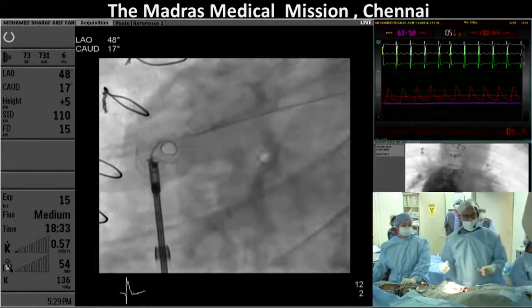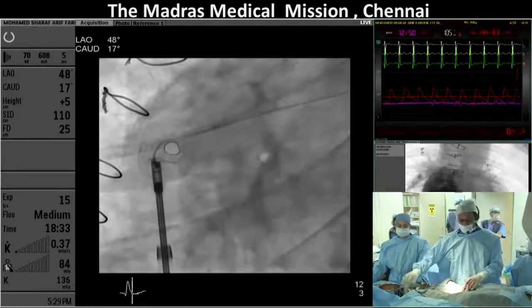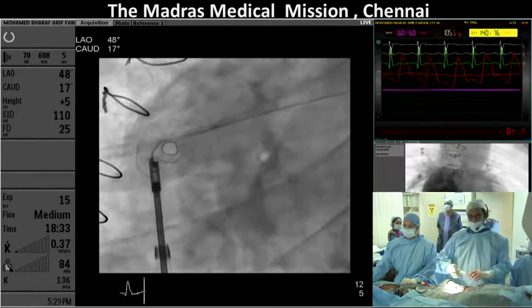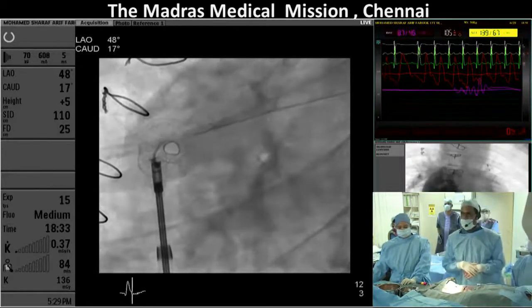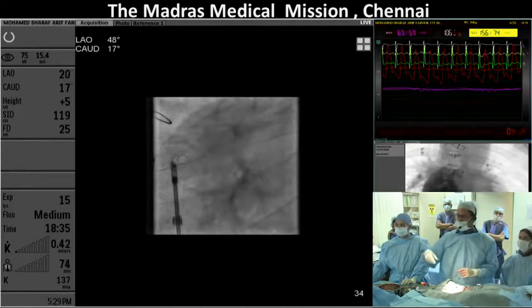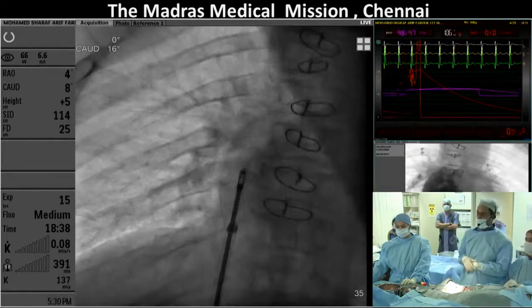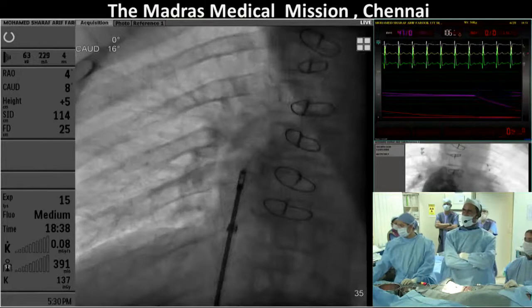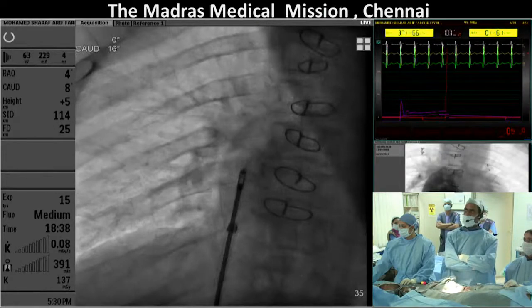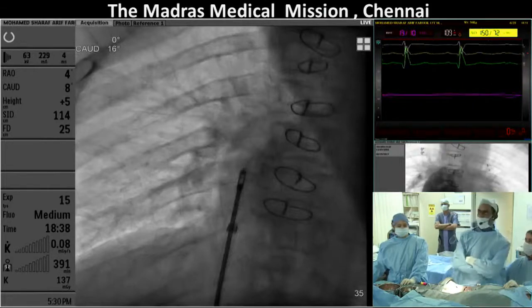So what is happening is the Fontan pressures, show the side arm pressures. Show it AP. Check your zero of the transducer quickly. The transducer is giving a very bizarre reading, so I am just checking the zero of the transducer. What pressure were you getting in the baffle? I can't see. The values are around 13 millimeters of mercury.